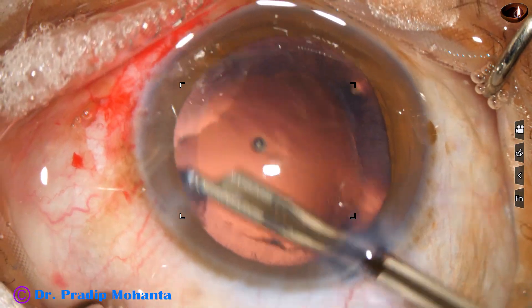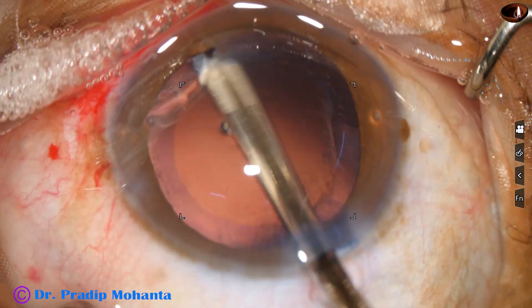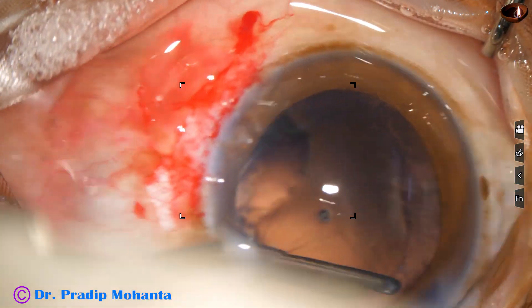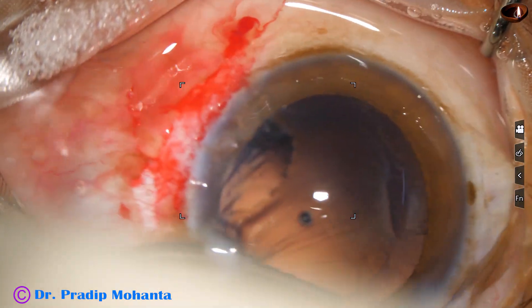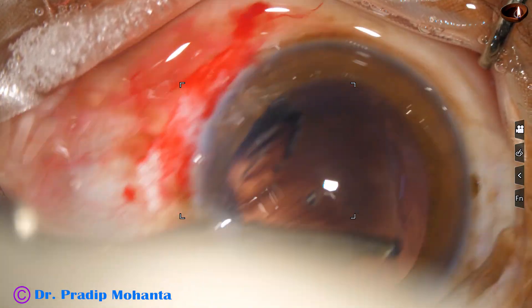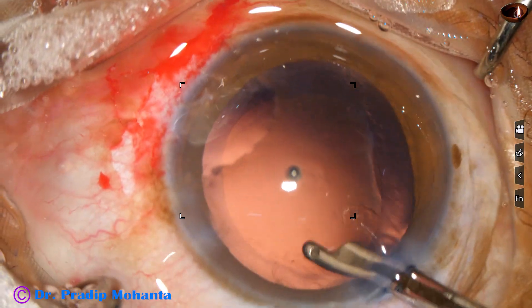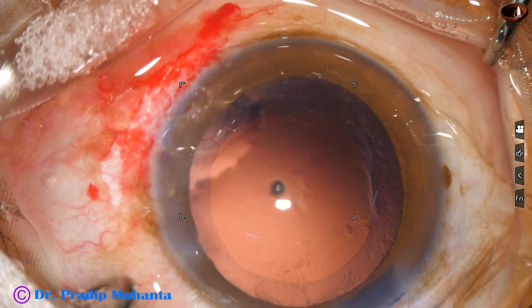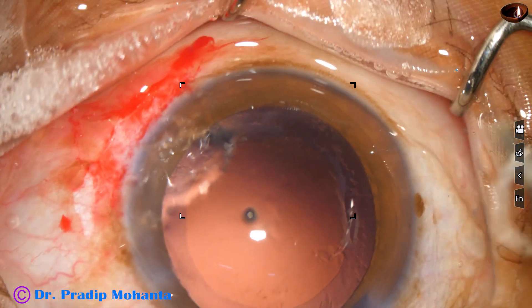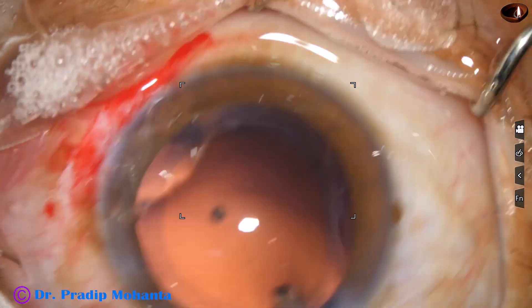Then I remove the cortex. Cortex all around is removed, going through the main wound. Sub-incisional cortex is removed going through the side port. Cortical cleanup is done. Some fibers are there, but the posterior capsule is clear. And this is polishing of the posterior capsule.